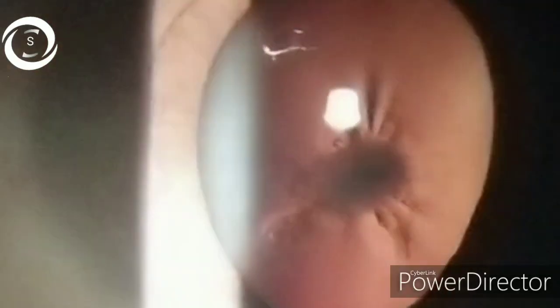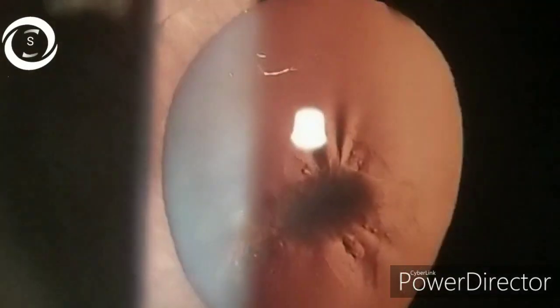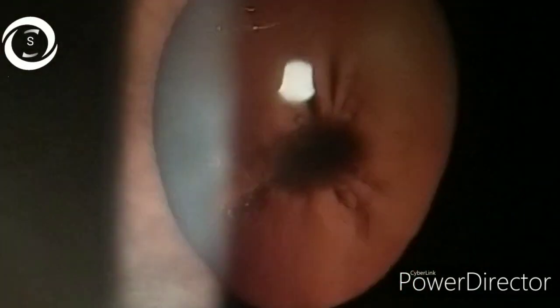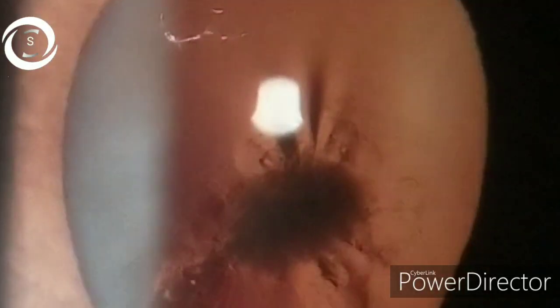Just look at this case of posterior subcapsular cataract, and now in another patient you can see a bug or insect-like posterior subcapsular cataract. You can see that the linear tracks arise from the central round opacity 360 degrees around.